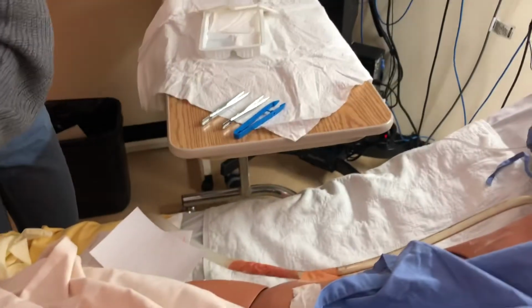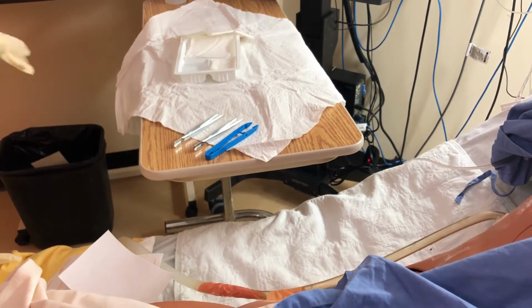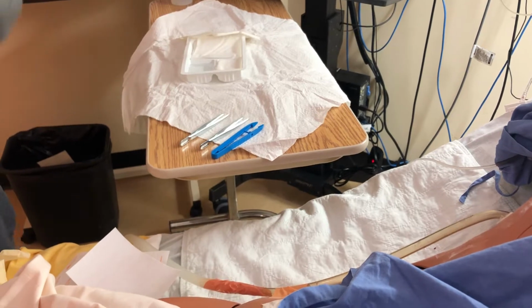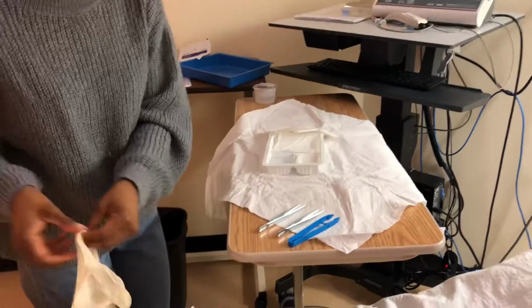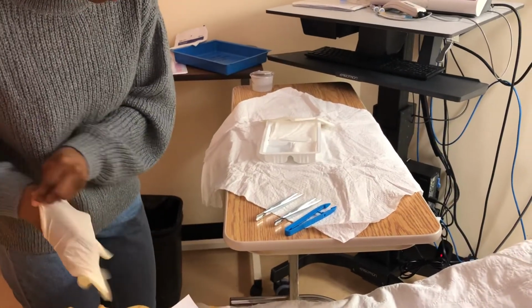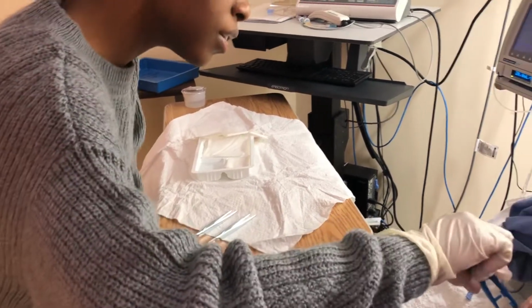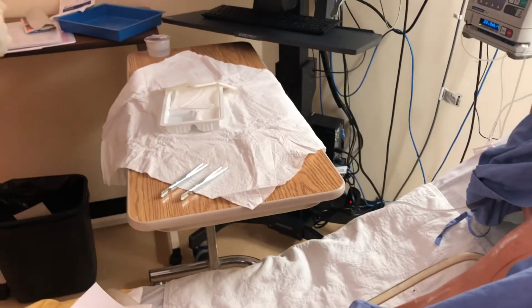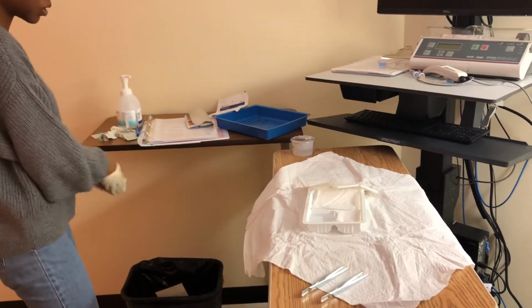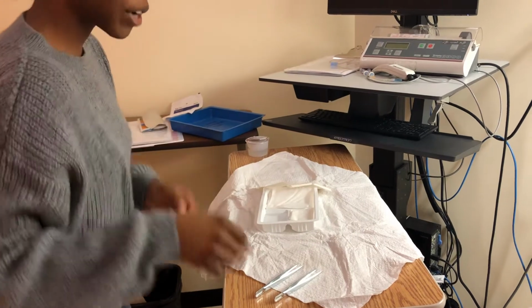So I'm going to assess the site for redness or swelling. There is no redness or swelling. I'm going to dispose this, and then I'll do my hand hygiene again, and then use this, and then make sure to stabilize. I'm gonna take this off, and I'll dispose this in the trash and dispose this as well. So I'll take off my old gloves. So now I'm ready to clean.